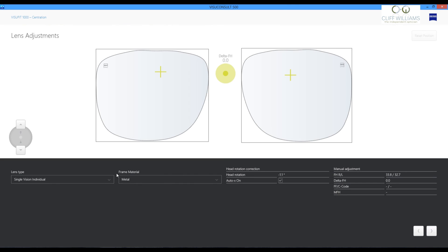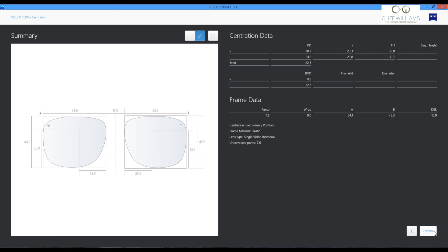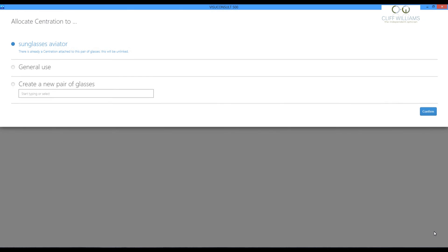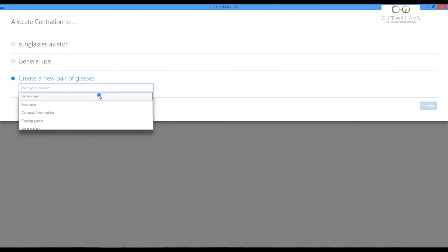Here we are just bringing the information into the software. We've got all the measurements for the pupil position. So that we can get the lens set up correctly. We'll then save that to the file. Naming it as a sunglass.